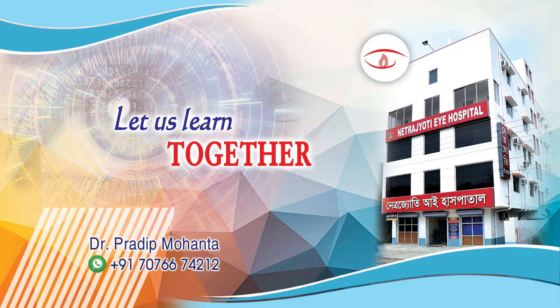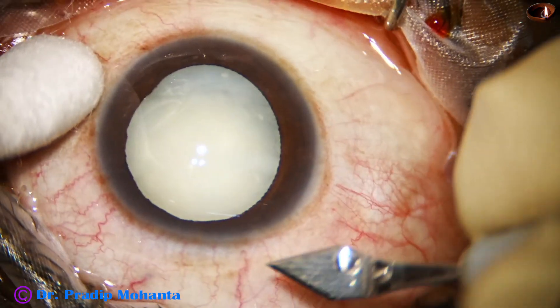Friends, welcome to my workplace for hands-on FACO and SICS training. Let us observe this totally unedited surgery.